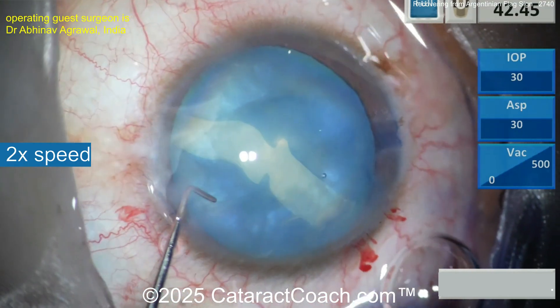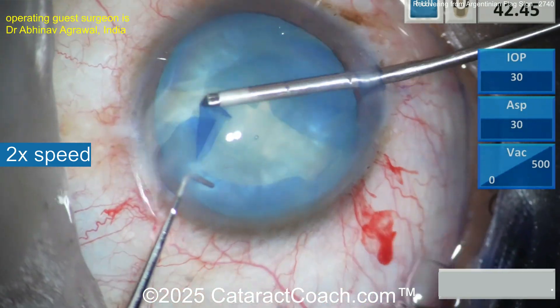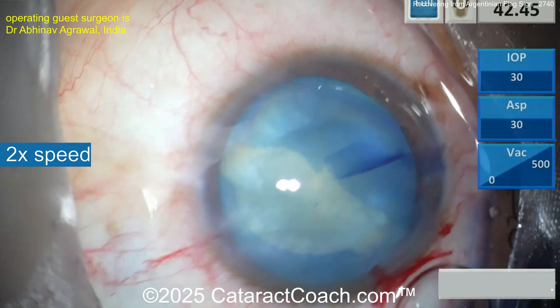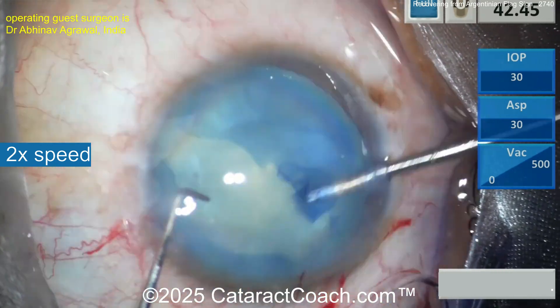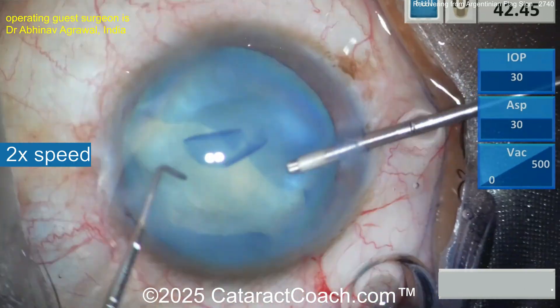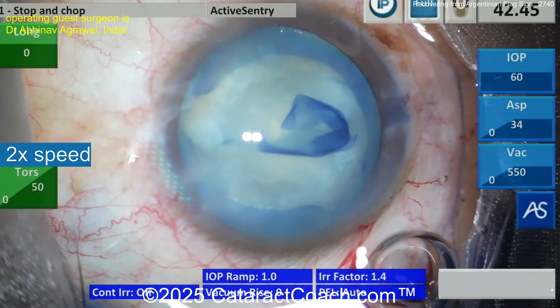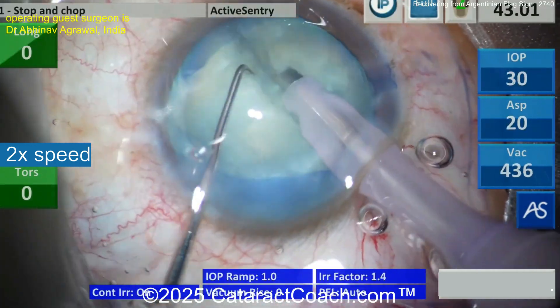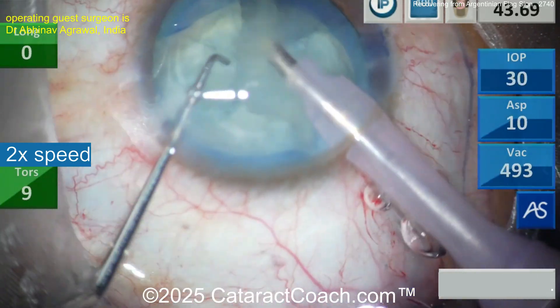So with that said, you can see here cutting now the capsule edge after decompressing the bag more. That's good. Using the micro forceps there, creating something of a nice round capsule opening, going the other side as well. Now remember back in the day, before capsulorhexis — I know it sounds crazy, but there was a time before capsulorhexis — people did what were called can opener capsulotomies, meaning they just get a sharp needle, a cystitome, and poke 20 or 30 times in a circular pattern. And so here now the surgeon doing a good chop technique, obviously a very experienced surgeon doing a beautiful job here.